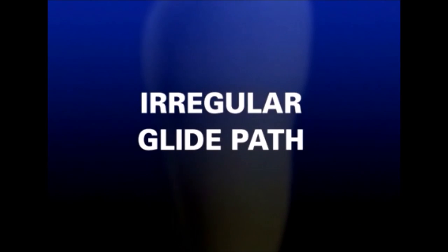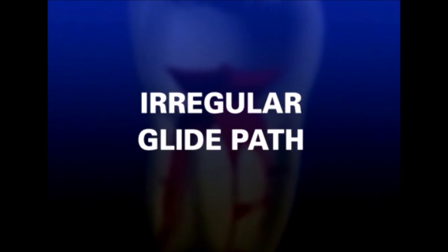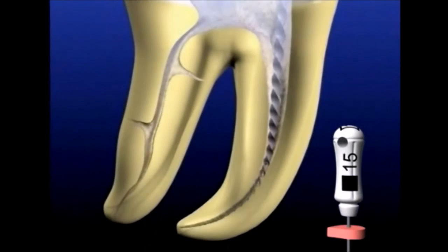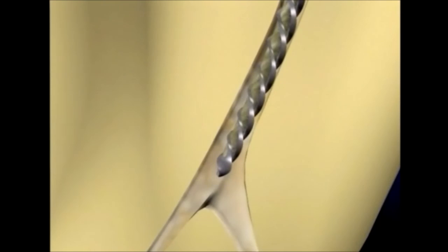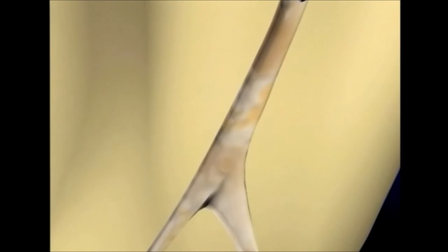The clinician must make a decision whether to finish the apical 1/3 manually or with nickel titanium rotary shaping files. How we do this is we check for the glide path. As we spoke about earlier, when the 15 file is snug and at length, we lift it up and without reciprocating the handle, we push it directly back to the radiographic terminus. Then we pick it up 2 millimeters and 3 and 4 and 5 millimeters, and in general, if the instrument cannot be slid to length because it hangs up on a bifidity or a canal anomaly, then we should consider manual finishing.